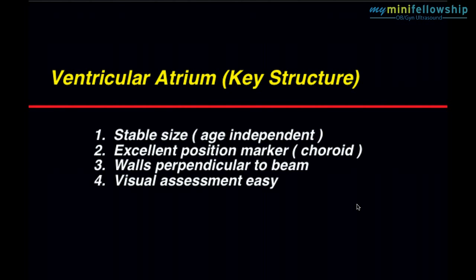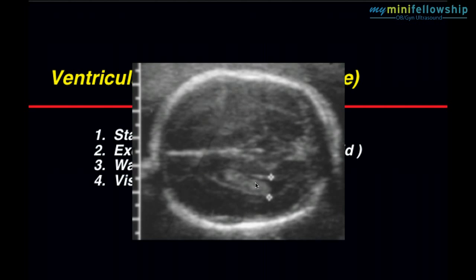Visual assessment is easy. There is a natural relationship between the size of the glomus of the choroid plexus and the size of the ventricular atrium, such that the glomus will fill or nearly fill the ventricular atrium, and if it does, no measurement is required. That is a normal ventricular atrium.